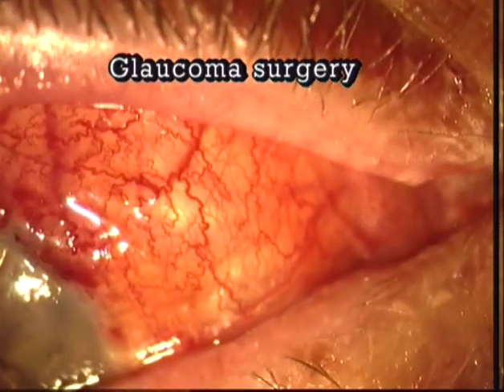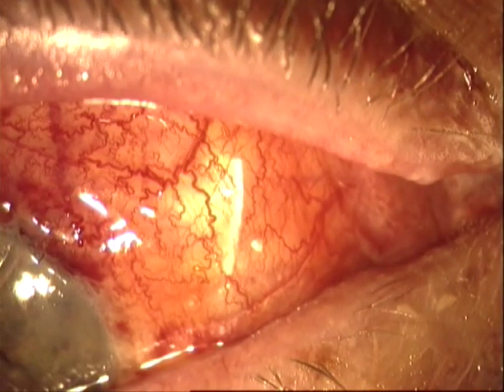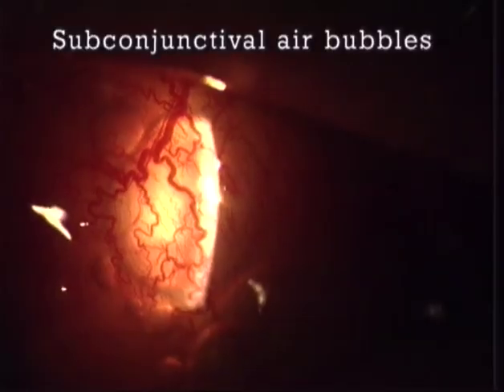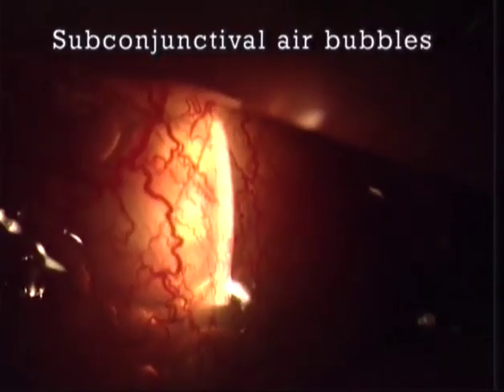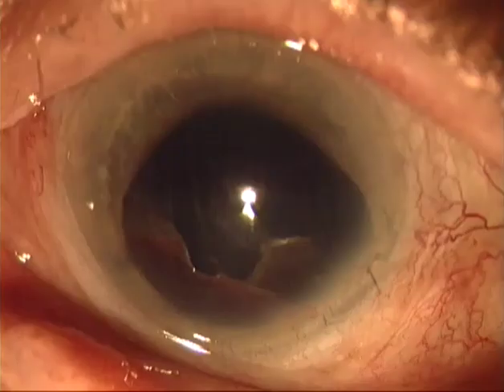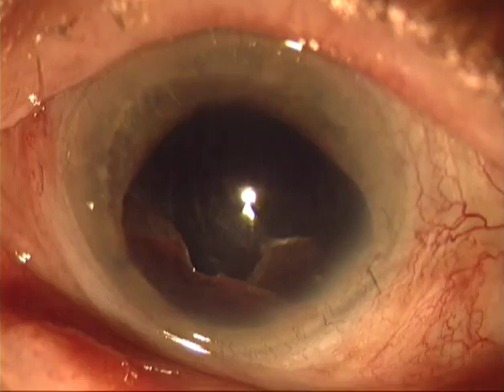Air injected into the anterior chamber has been expulsed beneath the conjunctiva. There, the air bubbles are invisible in general illumination, but they can be made visible with indirect lateral illumination. Here, the margins of the air bubbles are illuminated on the same side as the incident light, due to their lower index of refraction.